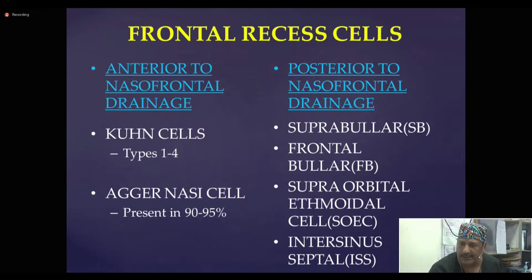Intersinus septal cell is a different cell which makes your frontal recess work more difficult by displacing the frontal drainage pathway laterally. And I am going to keep one of the cases to show the intersinus septal cell causing difficulty as well after the Draf cases.